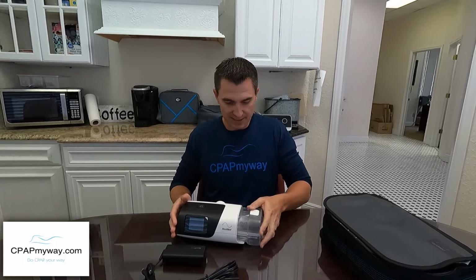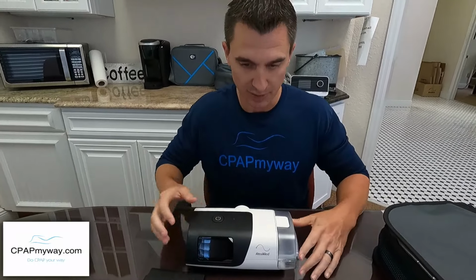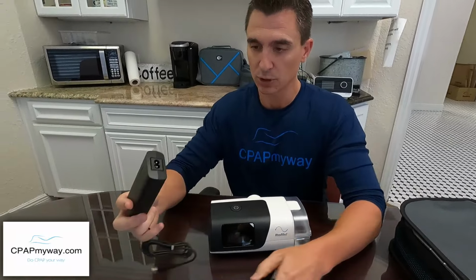Humidifier chamber slides right in the side, just like the old one did. There's some things about that I want to point out to you that are kind of neat, that are a little bit of an upgrade from the 10. Then, of course, your power cord is just going to plug up together here and then plug into the wall.